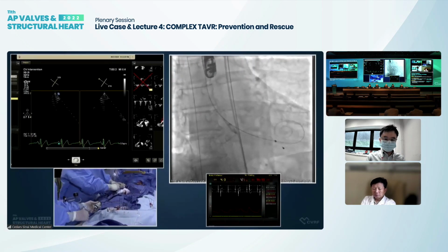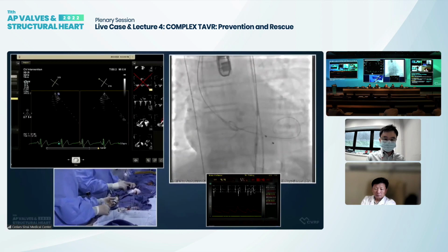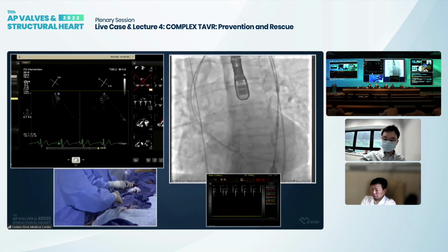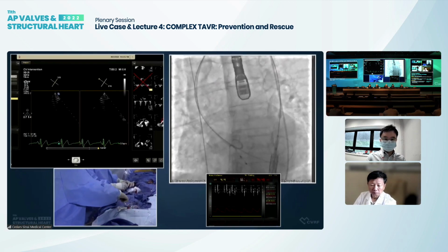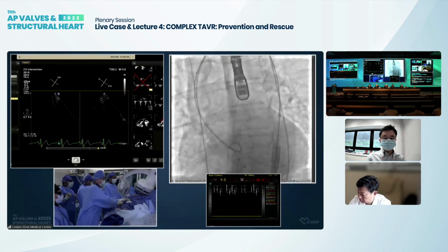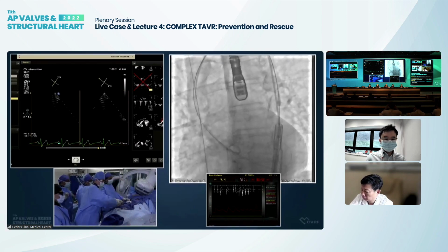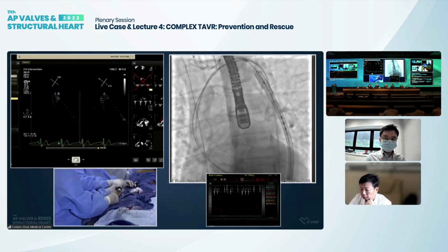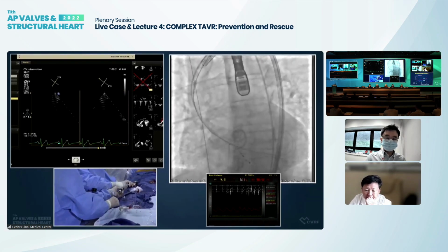And as you saw, we can argue, actually, some people would have called this a type 0 bicuspid, but when you look at the cross-sectional images, you saw some fusion of the leaflets and a little bit of a raphe, but obviously it was not calcified. It's not the raphe that is calcified, it is the leaflet calcium that is abundant, and the calcium score was almost 5,000. I think when you have a combination of calcified raphe and excess leaflet calcium, things are the worst. But excess leaflet calcium, of course, is where we've been humbled.